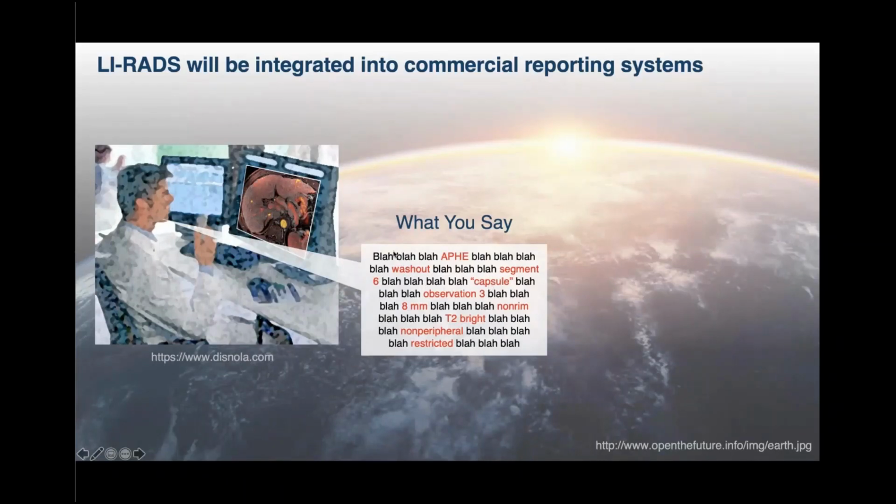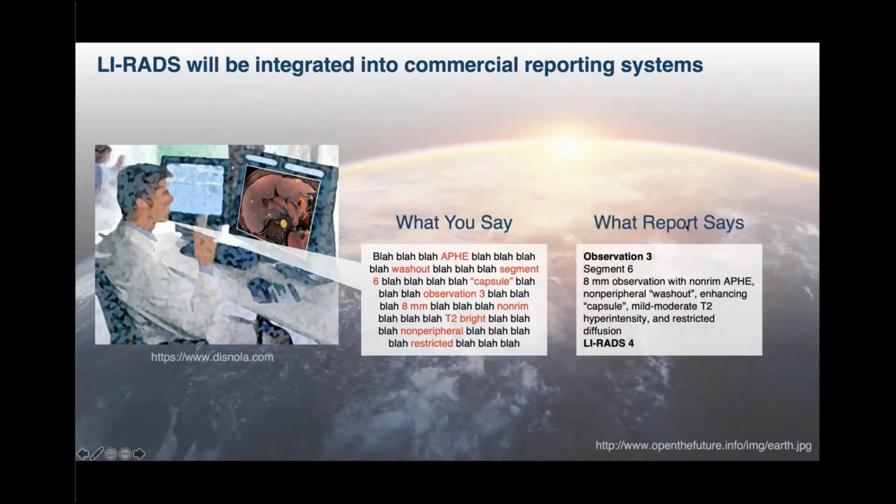But notice that we won't have to say it in an organized fashion. We can dictate potentially in a disorganized fashion as long as we are describing the key terms, and the computer will be able to organize our thoughts and apply the LI-RADS algorithm and provide a very organized report that's more organized, in fact, than our thought process.